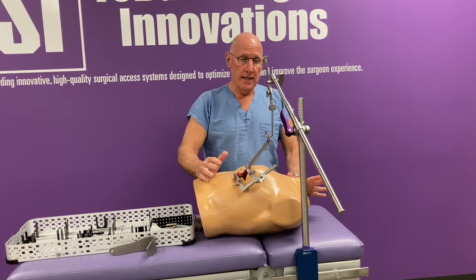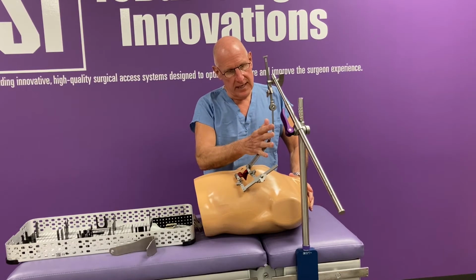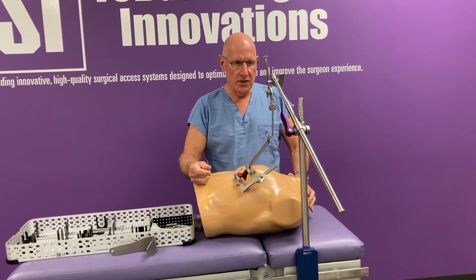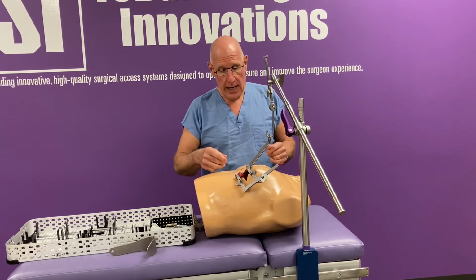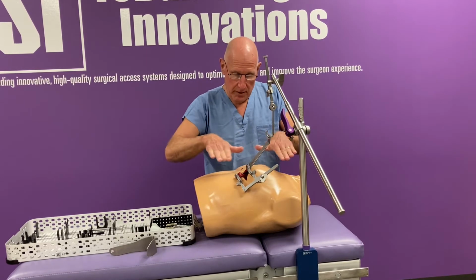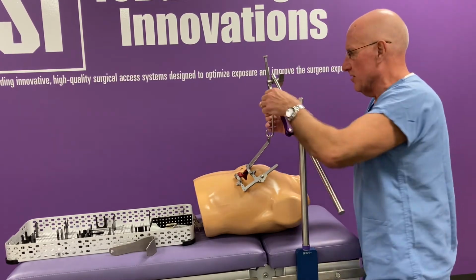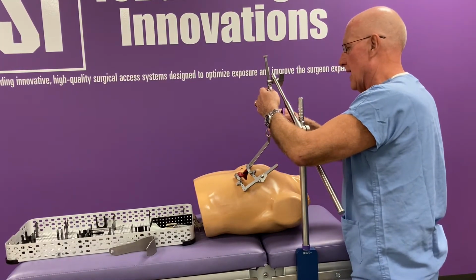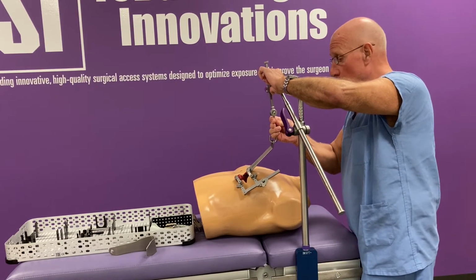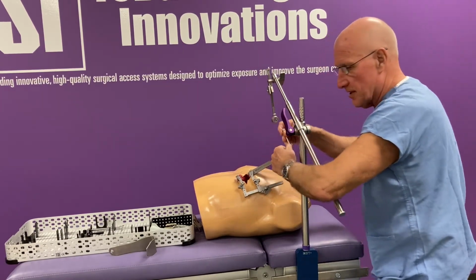Now, when we're done taking down the IMA, we can either leave the lift setup as it is and apply a stabilizer through this incision, or we can take it apart and change the retractor and go through with the retractor in its normal position. So I'm going to show you exactly how we'll achieve stabilization using that. So to do that, I'm going to go ahead and release the lift mechanism, again holding this so that it doesn't drop down all at once. Just go through the reverse setup that we did before.